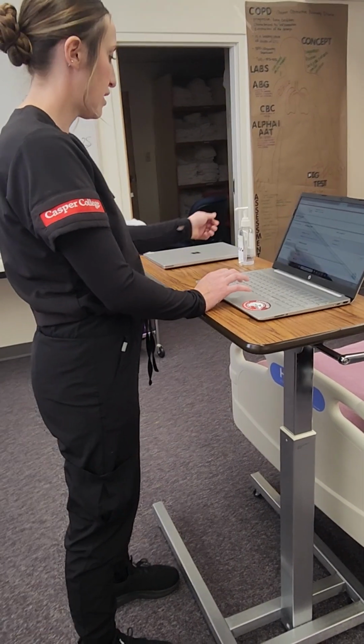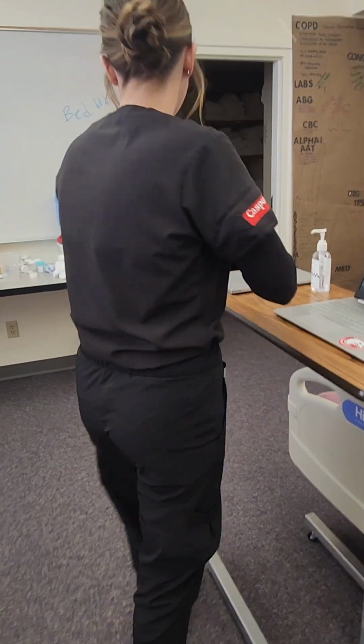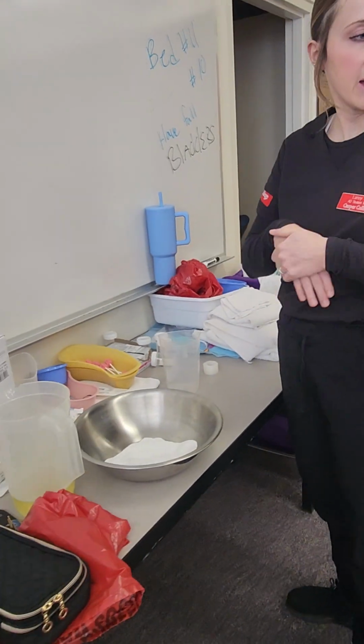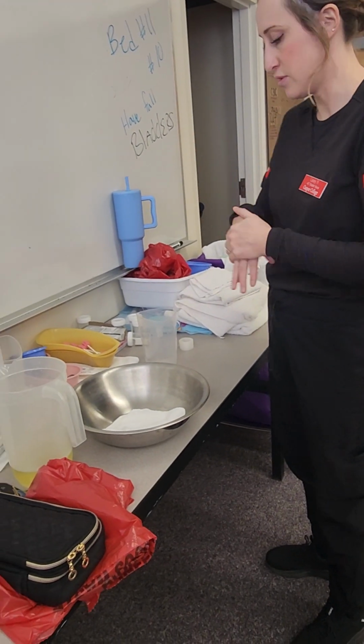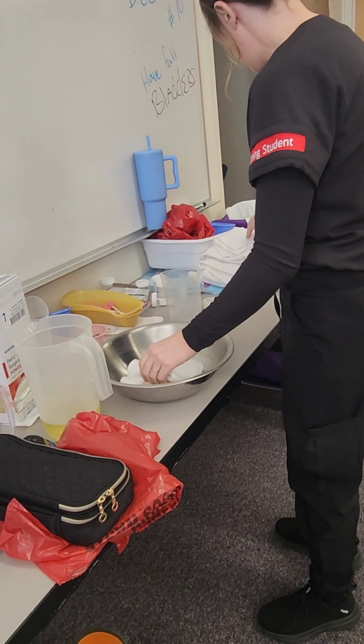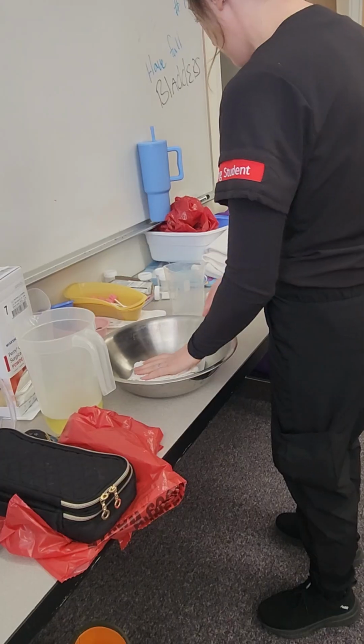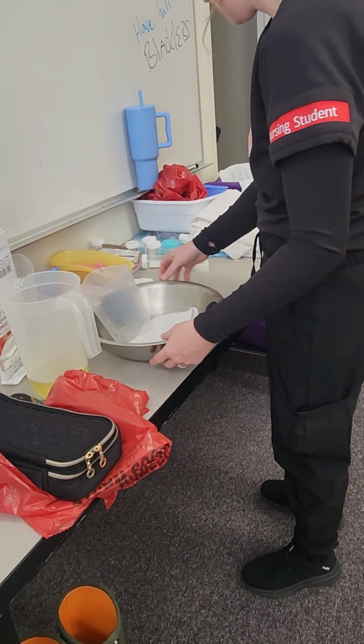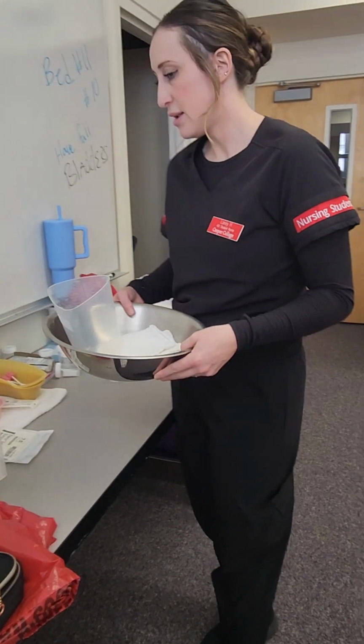I'm going to gather my supplies for this. So I already have a hazmat bag or red bag in the patient's room, so I don't need to gather that. I'm going to do pericare, so I'll grab that. Empty his catheter bag and this. And I think that's all I need.